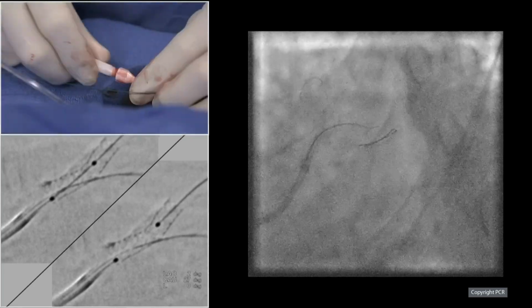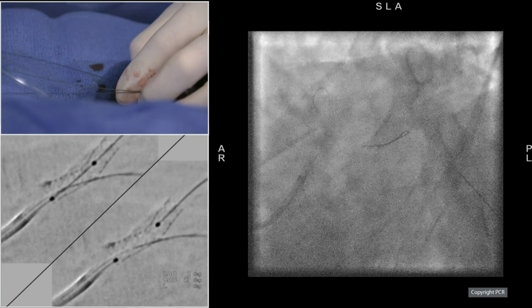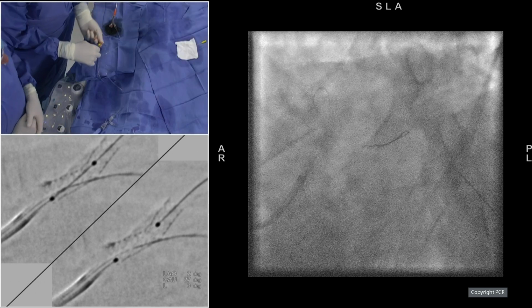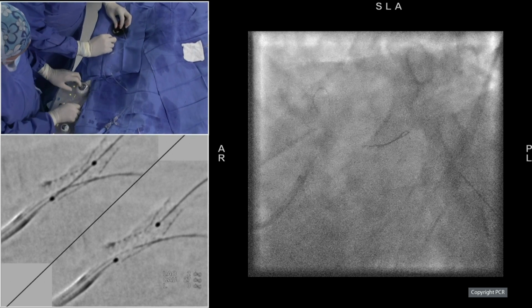You know, it's just a matter of patience. Really, it's the part of the procedure where you have to take time. There are several parts where we have to take time. When we remove a big balloon from the left main, because you can have a deep engagement of the guiding, and you can crush the stent. There is this part also. It's a matter of patience.